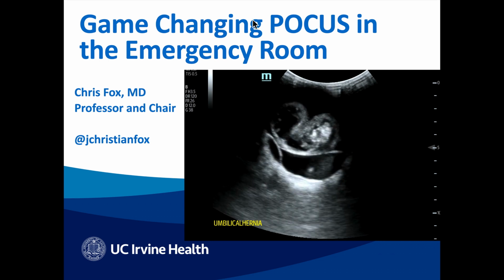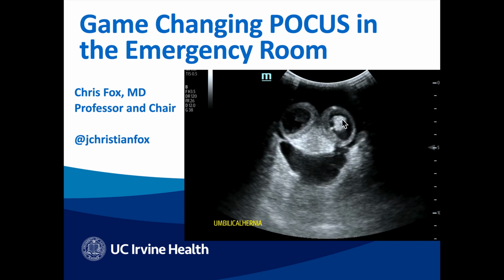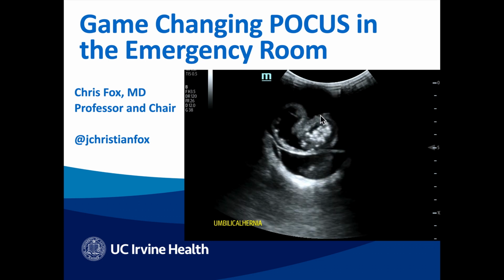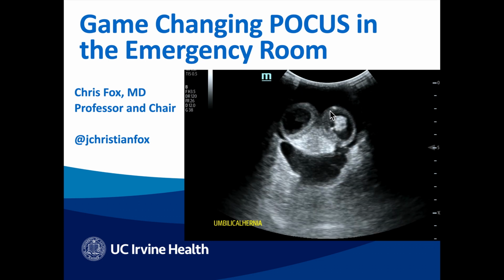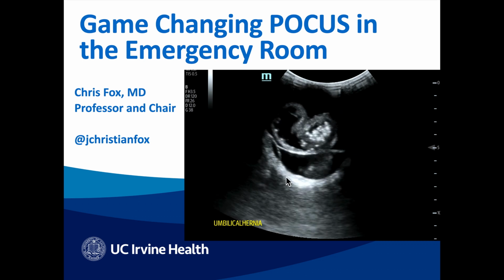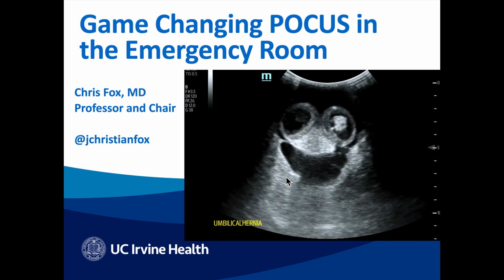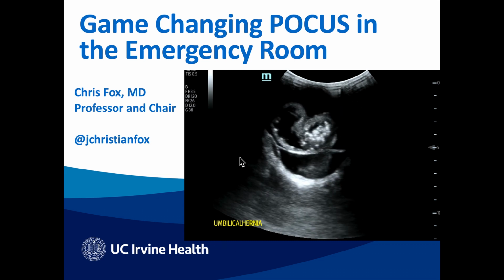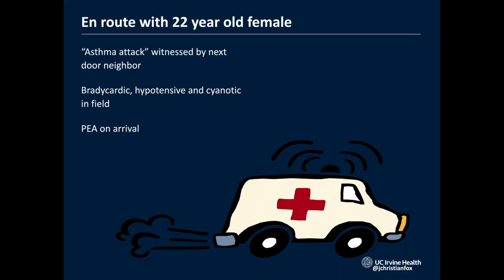All right. I love this ultrasound video because it looks like a happy face. It's actually a bowel obstruction, but it looks very happy. We see maybe some ascites here and some loops of bowel floating around and some plicae circulares down here. It's kind of fun to see a bowel obstruction in the setting of an umbilical hernia when there's a big happy face.